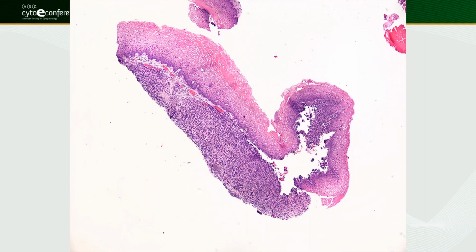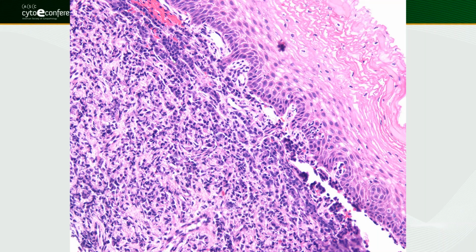So this is the follow-up biopsy, and you see the submucosa here. These are tumor cells, and you see this typical lobular carcinoma, single-file type of growth. And when we used to do a lot of breast FNAs, that targetoid cytoplasmic mucin is also pretty characteristic of lobular carcinoma.